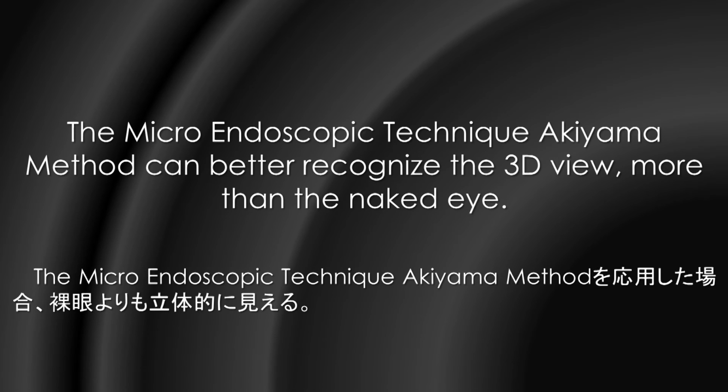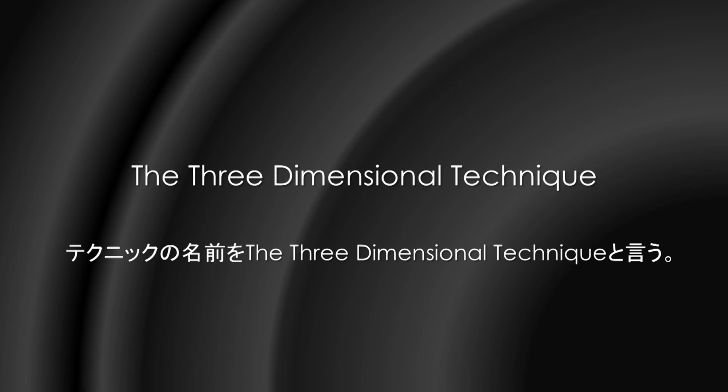The microendoscopic technique, the Akiyama method, can better recognize the 3D view more than the naked eye. The technique name is the three-dimensional technique.